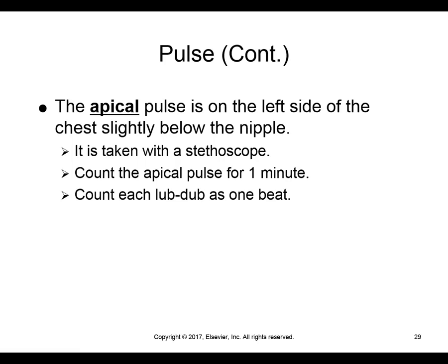You're going to listen and you're going to hear lub dub, lub dub, lub dub. And so, lub dub, that is one beat, okay? And we can do some practicing of that in class.